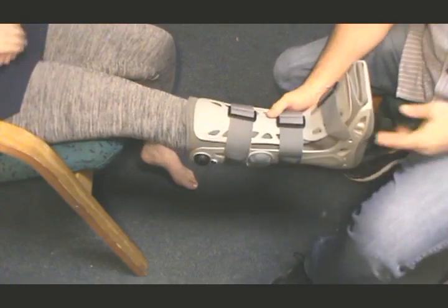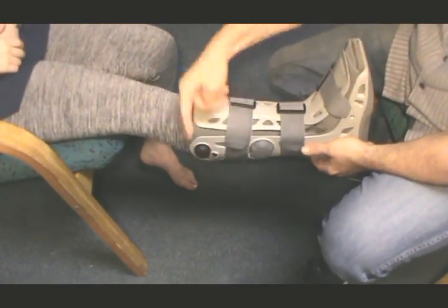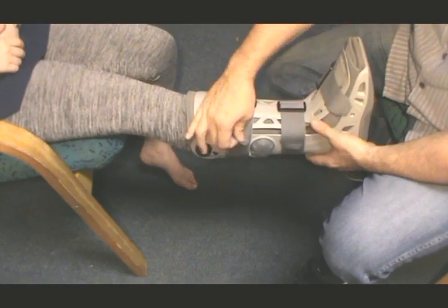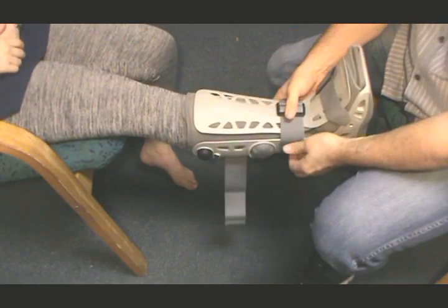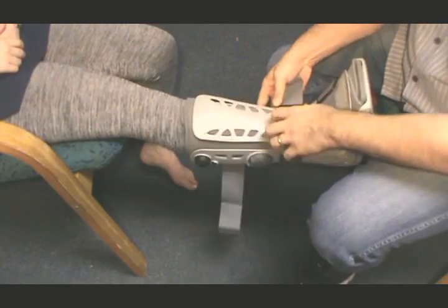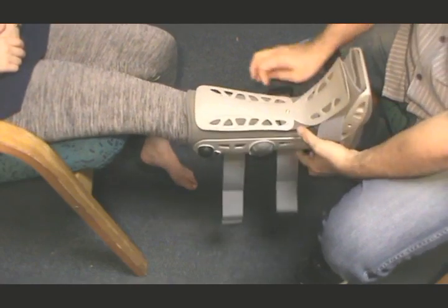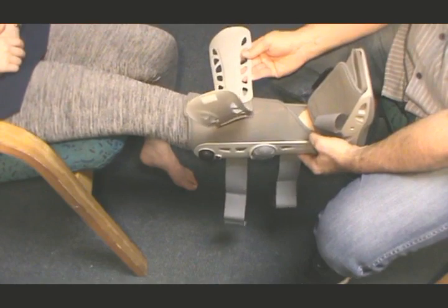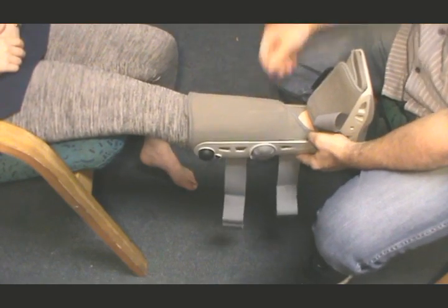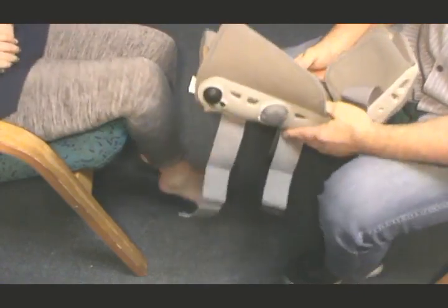Alright, to remove the boot, as you see, just make sure that you've released all the air, and then you're going to remove the straps. And off comes the top. This is if you're going to have to bath. So you'll remove that, you'll remove the foam and the foot.